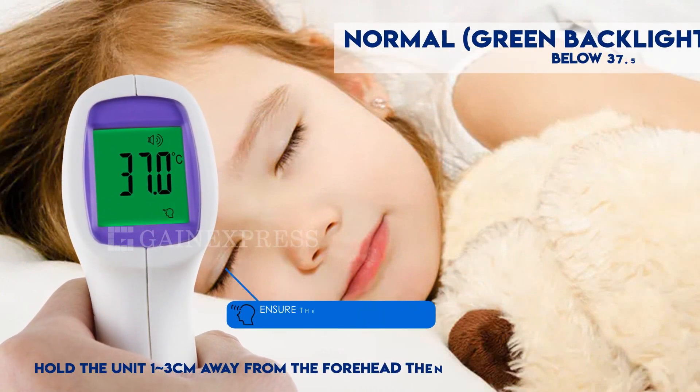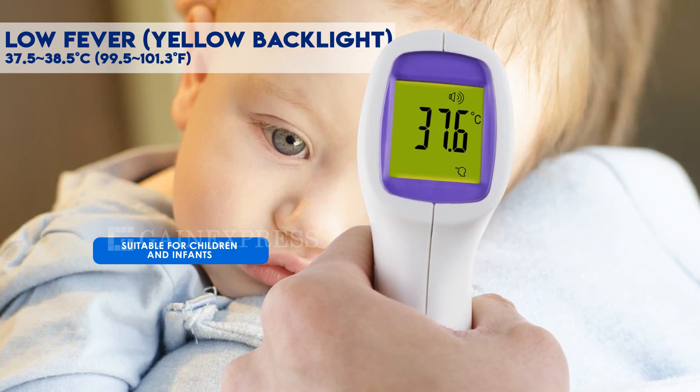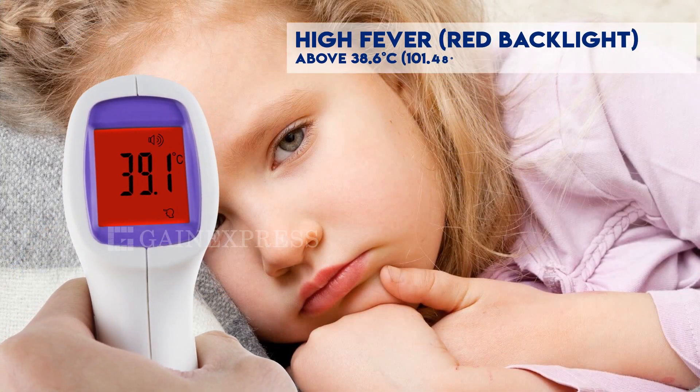In body temperature mode, green backlight indicates below 37.5 degrees Celsius. Yellow backlight indicates low fever. If the backlight becomes red, it indicates high fever.